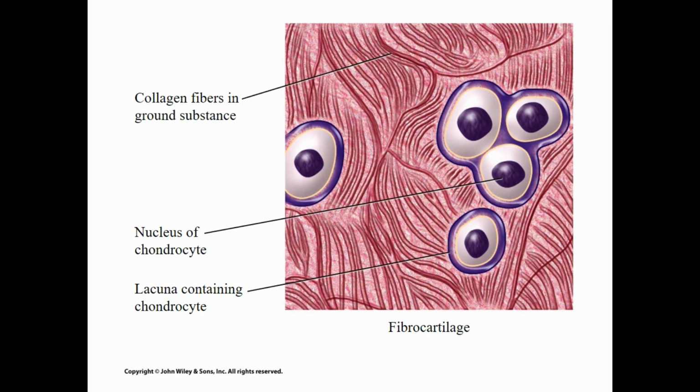And here is the artistic version. So we can see these fibers, these densely packed collagen fibers running through the extracellular matrix.